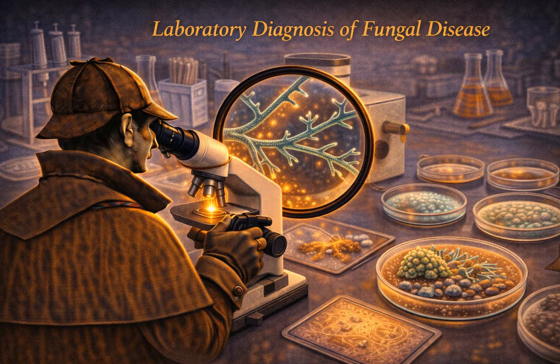Looking isn't enough for definitive proof. You have to prove it can actually shapeshift. You grow it at 25 degrees and you see a mold. Yeah. Then you take a sample of that mold, streak it onto a fresh, rich plate, and stick it in the 37-degree incubator. If it converts into a creamy yeast colony after a few days or weeks, you have confirmed beyond a doubt it is a dimorphic true pathogen. It's literally like catching a werewolf transforming. You have to see both forms to be absolutely sure.